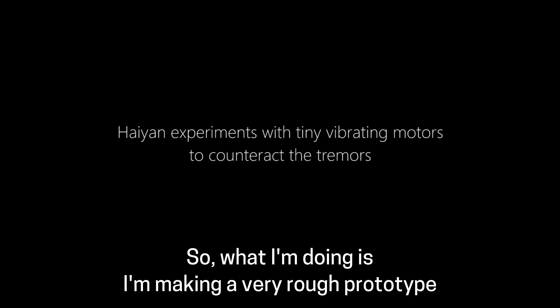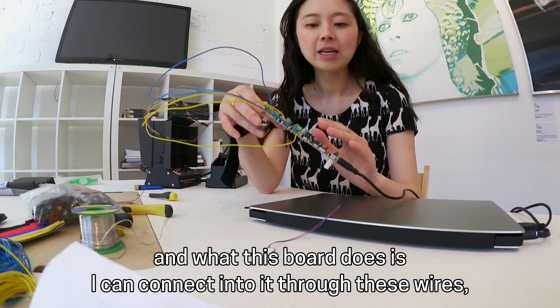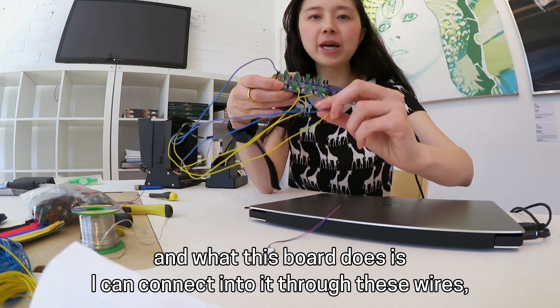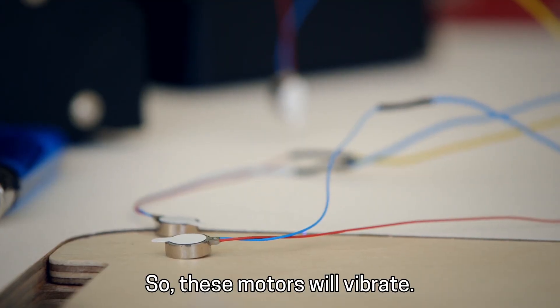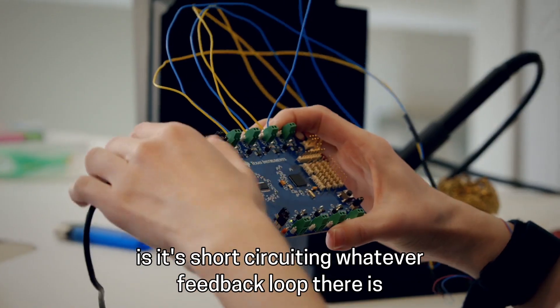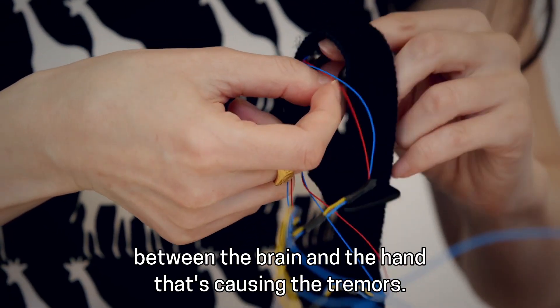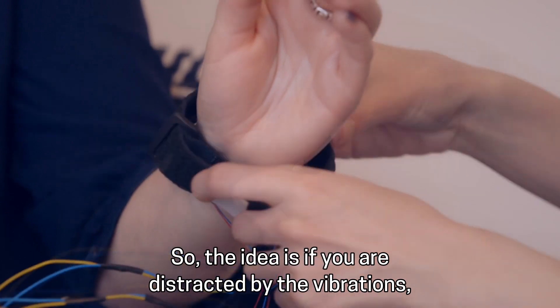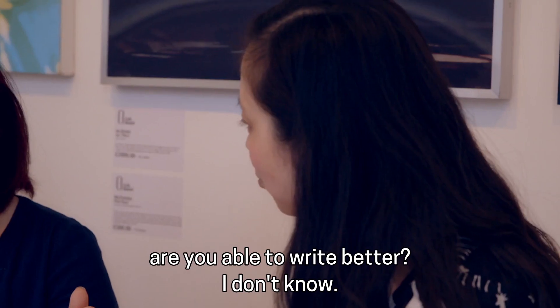What I'm doing is making a very rough prototype. This board lets me connect into it through these wires — tiny coin cell motors. These motors will vibrate. I personally think what this is doing is short-circuiting whatever feedback loop there is between the brain and the hand that's causing the tremors. So the idea is: if you are distracted by the vibration, are you able to write better?